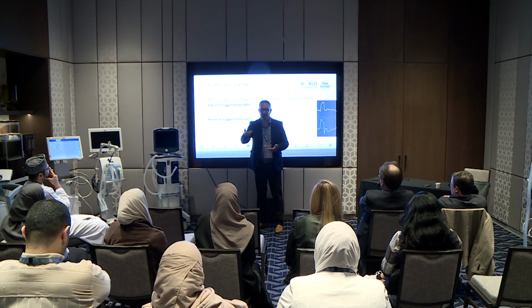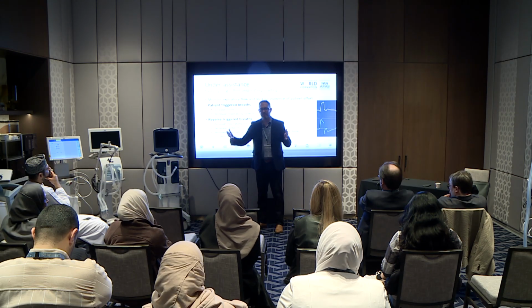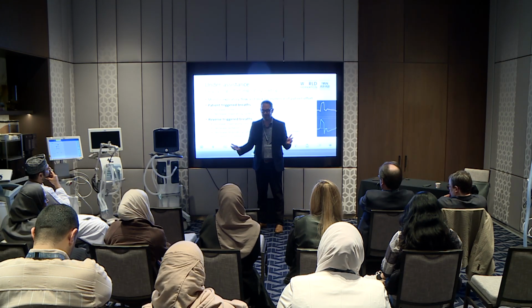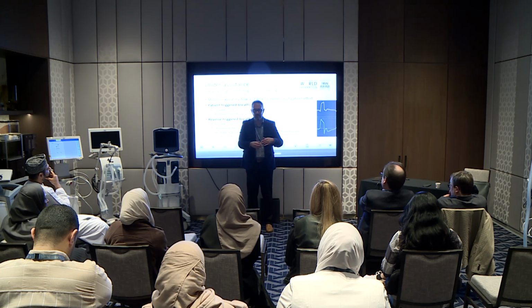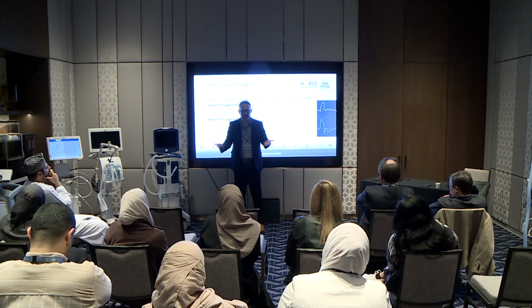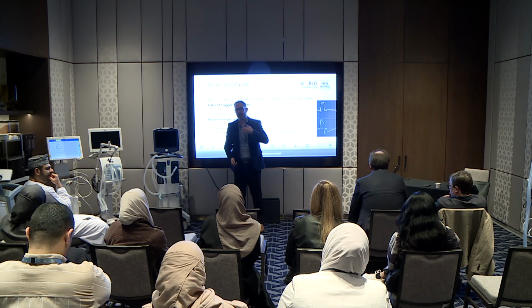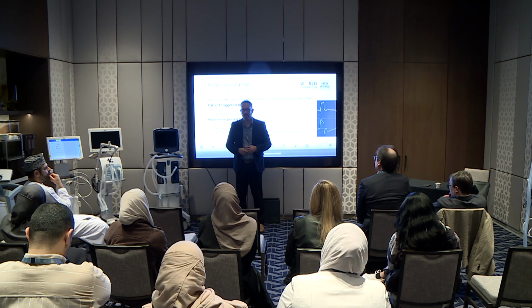If my rate's at 20 or 25, I'll turn it down to 10, and I'll wait. If the resulting respiratory rate is still 10, with reverse triggering still happening, because every time the stimulus happens, they follow your respiratory rate settings, like if they just continue to have the exact same problem on a rate of 10, I'm not confident they can gas exchange as well as I need them to. They can't maintain a minute ventilation yet.